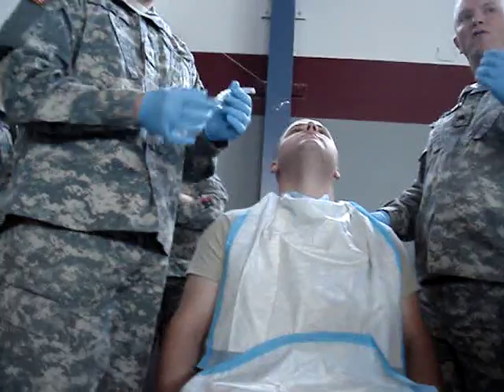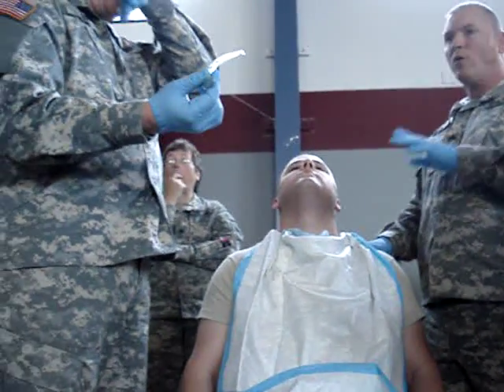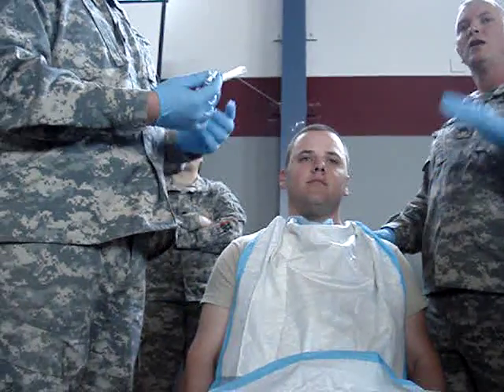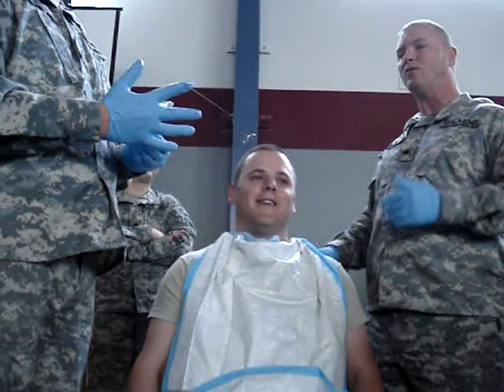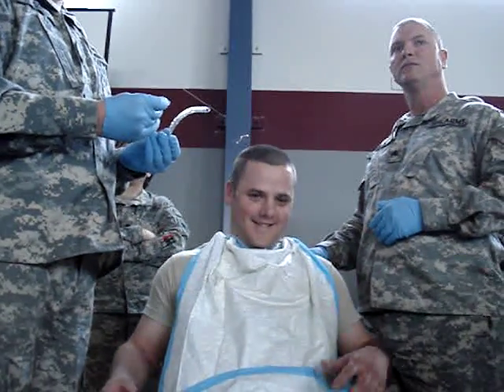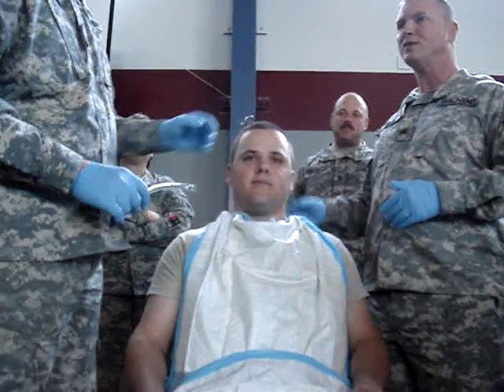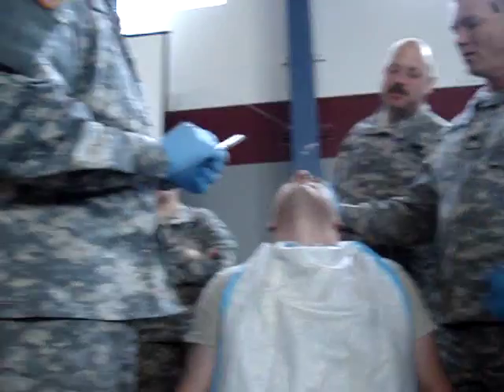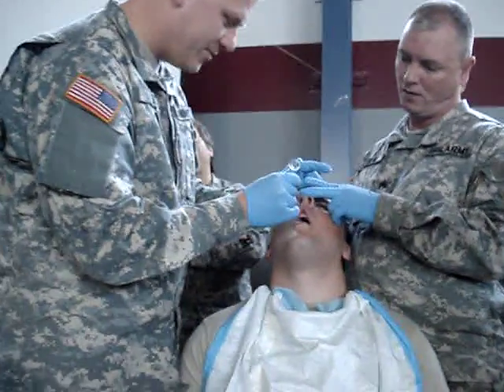We always start with the bevel toward the septum, right? Correct. Now, we always start on what side? The right. Now, if we look at the person and the left looks a little bit better, do we still start on the right? Yeah, go ahead and do it anyway — unless you're real experienced. Let me take a picture of that tube you've got sticking out. No. Come on, Lopez. Look at that thing. Hey, shut up.